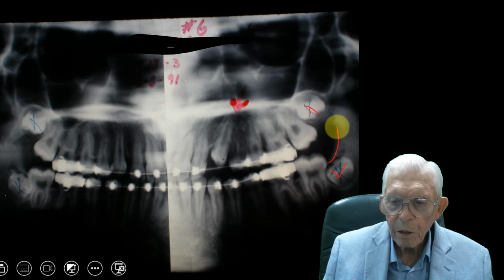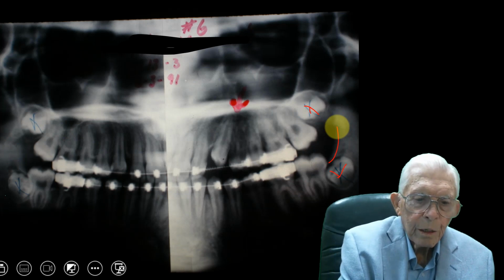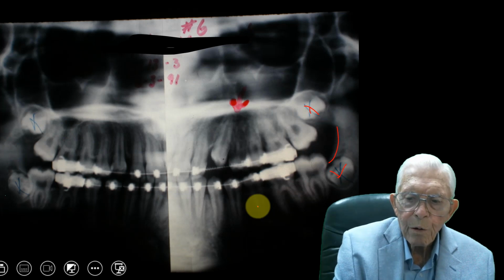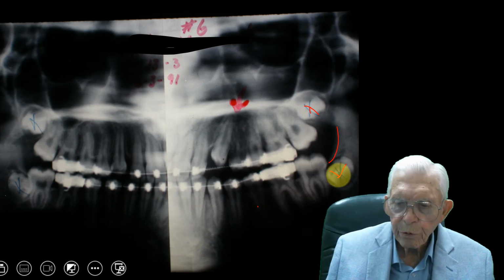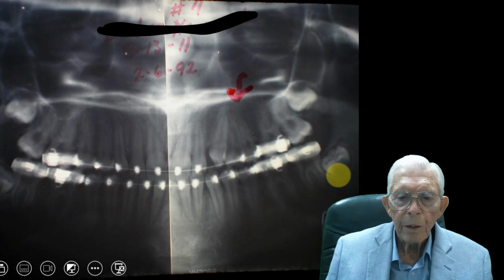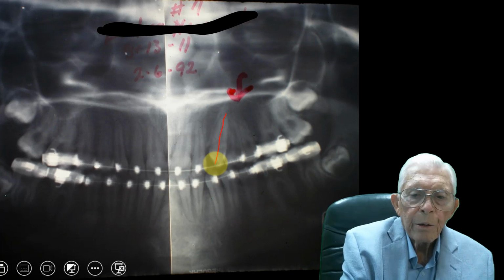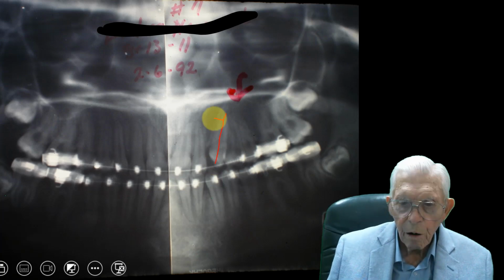If she was, we'd keep the wisdom teeth. Or if we had sacrificed something in here, we'd pull this forward, might have more use for the wisdom tooth. But here we don't have any use for them, so we're going to recommend removing them at this point. So here we got the cuspid down in here now. We're going to have to turn it around, put the root back forward.